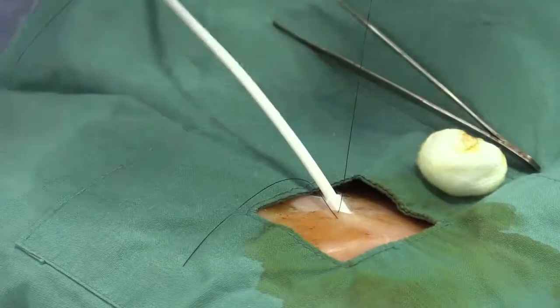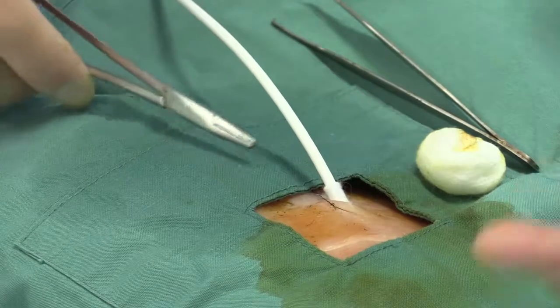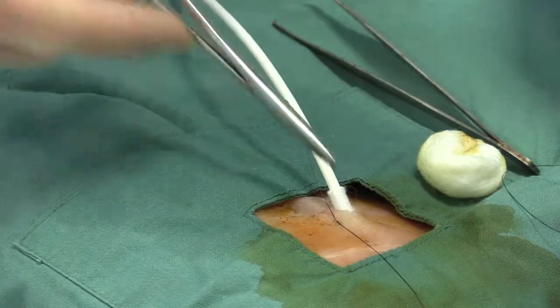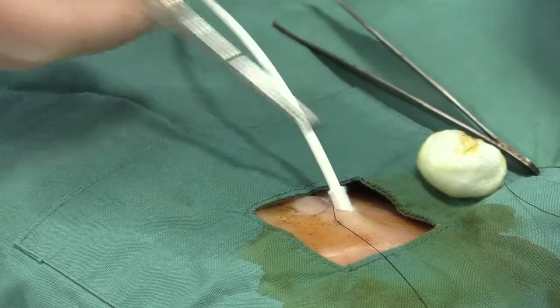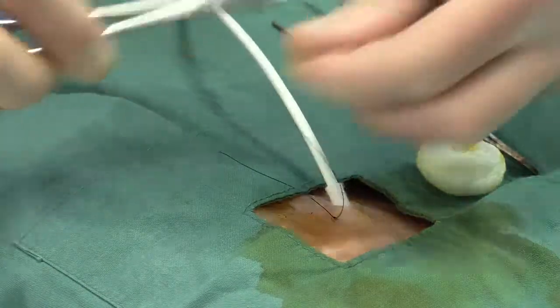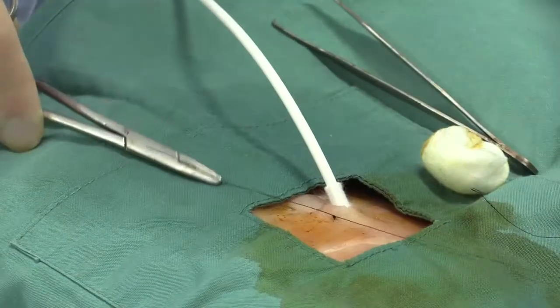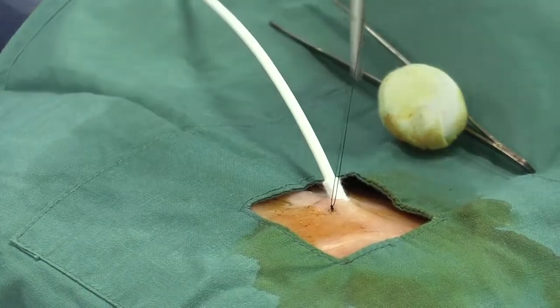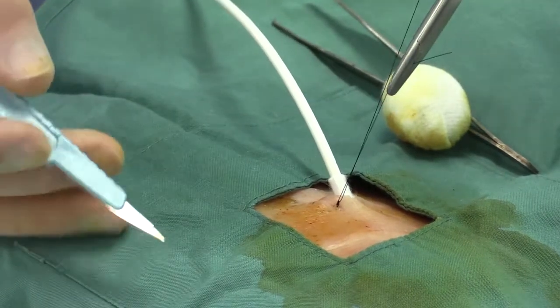Catheter is inserted into the correct position. And the purse string suture snugged down. If one gets significant blanching of this tissue within the circumference of the suture, it is probably too tight and should be released slightly. Again, you're trying to create a watertight apposition, not strangulation of the tissues. All monofilament sutures should have at least 6 knots thrown in them.